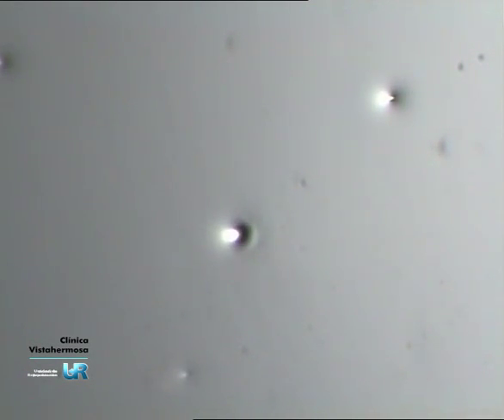Sometimes to eliminate totally the cytoplasm, it is necessary to add a second drop of hypotonic solution, or if the ambient humidity is less than 30%, to increase it by exhaling slightly on the blastomere in a tangential way.